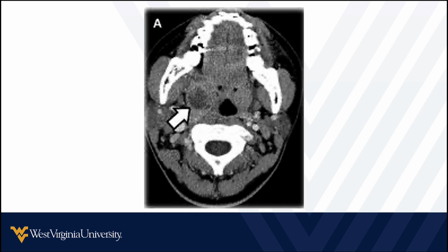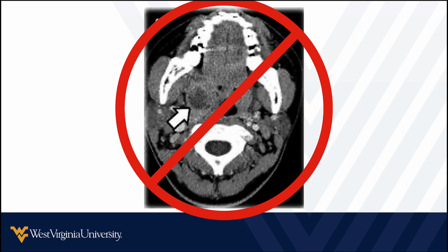And I'm on kind of a mission. I really want to put a stop to this. Most cases of peritonsillar abscess can be diagnosed without CT scans. And these are young patients. We really want to try to minimize radiating their upper neck and torso if we can. And we really don't need to. Using point-of-care ultrasound, most of the time, I think CT scan can be avoided.